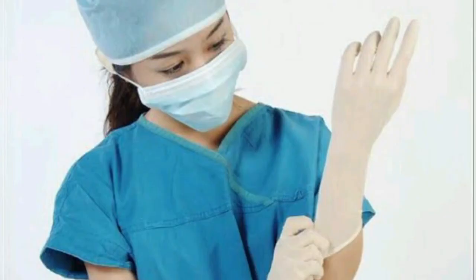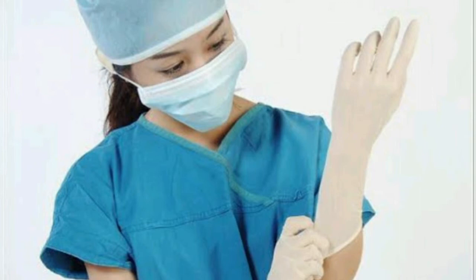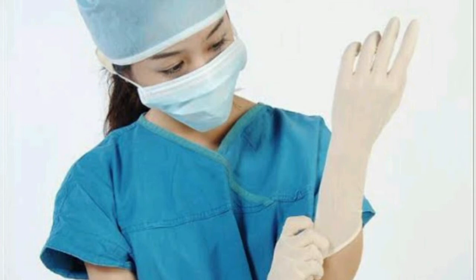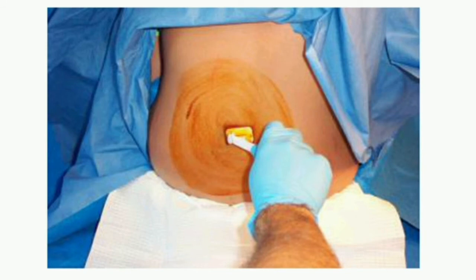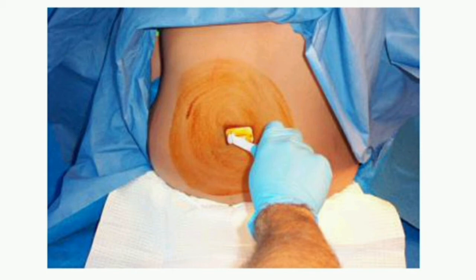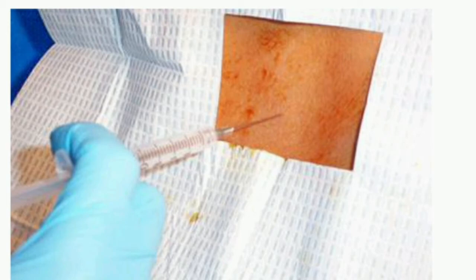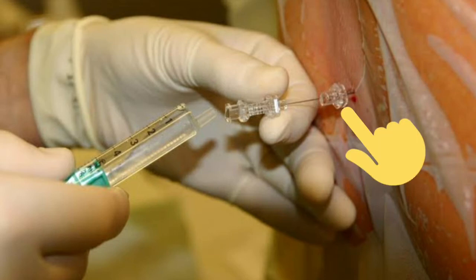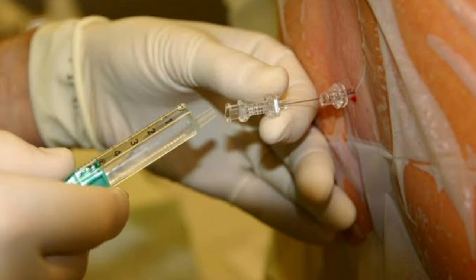Now wash your hands, put on sterile gloves, and use sterile technique. Prepare the tray in sterile fashion — an assistant may help with opening specific items in sterile fashion. Prepare the back with an antiseptic, starting at the area of intended injection and moving outward. This is done three times. Place a skin wheal of local anaesthetic at the intended spinous interspace. Smaller gauge needles will require an introducer to stabilize the needle. Place the introducer firmly into the interspinous ligament.